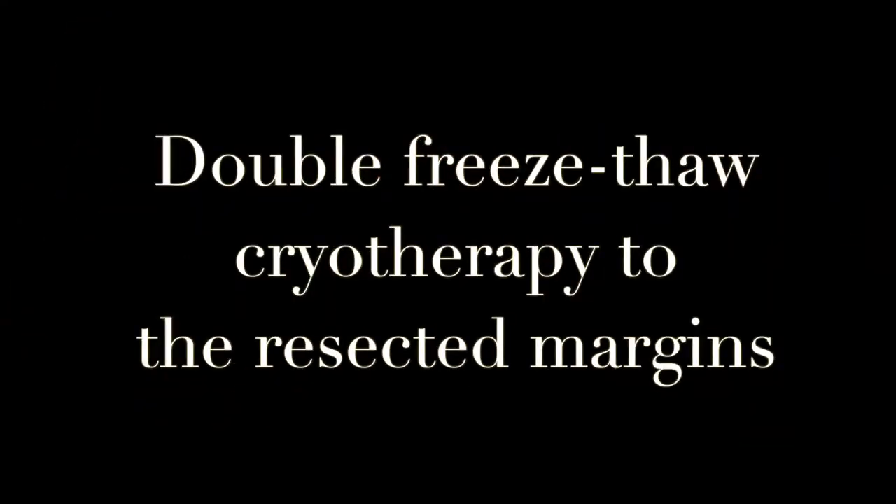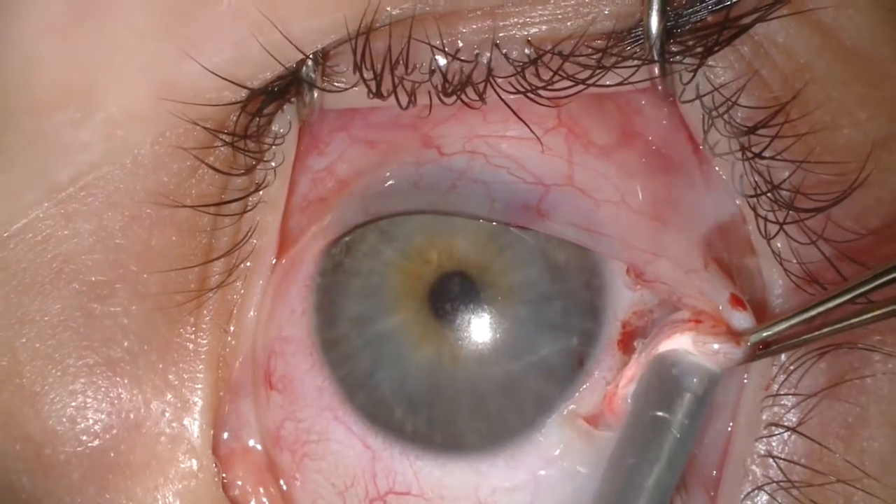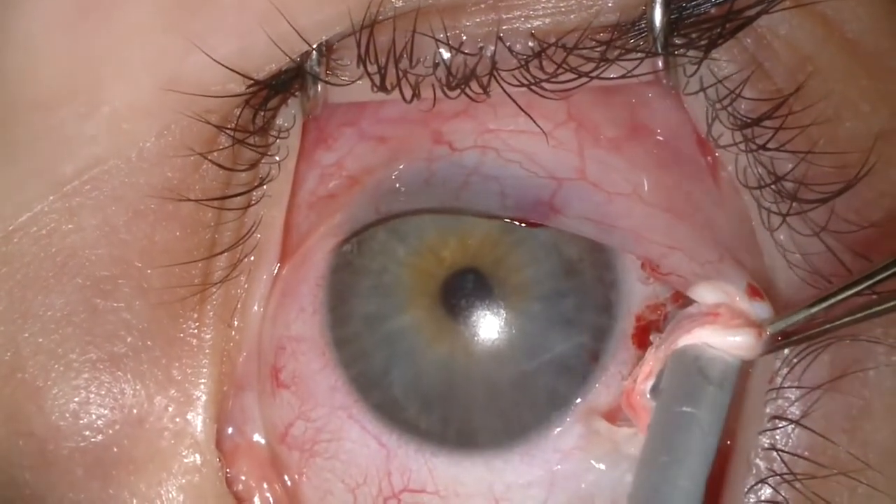We use double freeze-thaw cryotherapy to the resected margins. We like to apply our cryotherapy from the underside so you can watch it freeze full thickness. In some instances when it's really tight, you must approach it from the over side and twist the tissue to watch it freeze underneath.